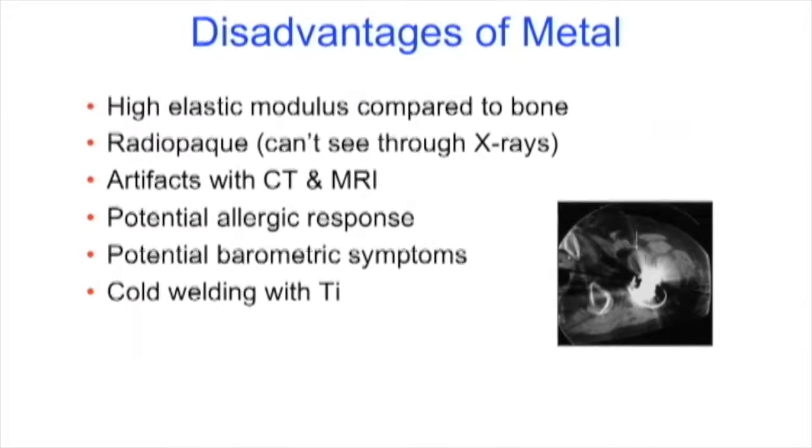And so the primary reasons why we put in distal femur plates are for old ladies who have these periprosthetic fractures and they don't heal very well, and you have a massive degree of non-unions, almost 25 to 30%. Well, titanium solves some of that problem, but we're still seeing the exact same problems with titanium. The modulus was still a little bit too high. They weren't able to really get the stress strain that they needed for healing to occur, and there was a big problem with non-union sites in that area. We are now starting to see, and hopefully John's study can really show this, that carbon fiber may be the answer to this.